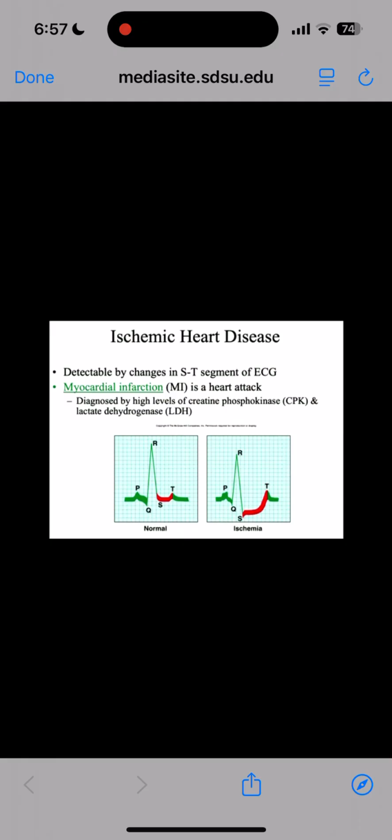Cardiologists look at normal ECGs for about 4 or 5 years to know what's normal, to understand all the measurements. And basically, one of my friends who's a cardiologist said, it's a pattern recognition. It's kind of like looking at faces. If you look around our classroom, everyone you'd look at, you'd say, oh, they have a normal face. 2 eyes, a nose, a mouth, 2 ears, a chin, maybe a hairline, okay? But everyone's face is unique and different. That's the case with the heart, because it is slightly different shaped, it's in a different position, and now if you look at the positions of the dipole, you all of a sudden see something that looks wrong.